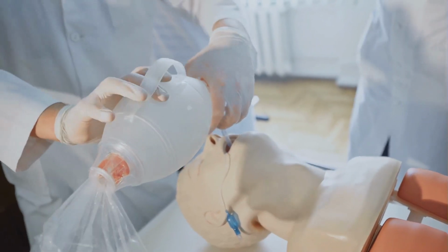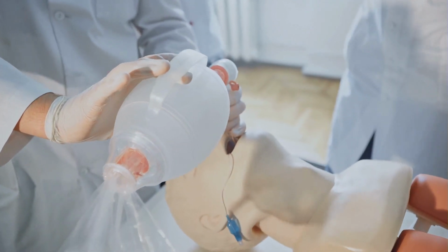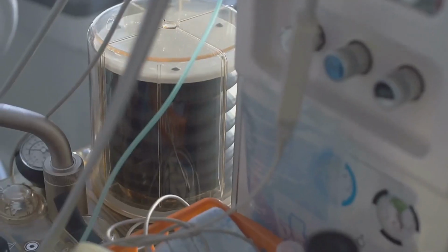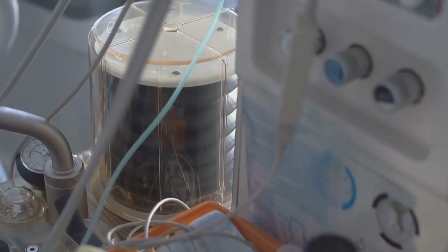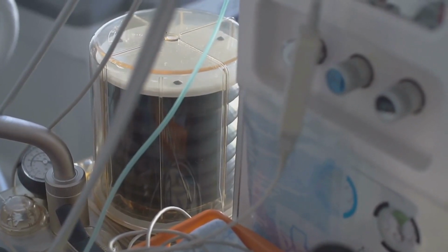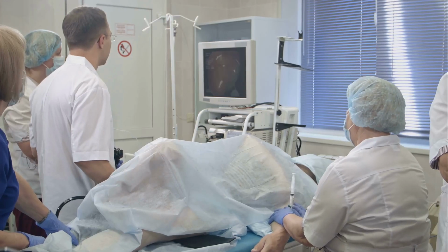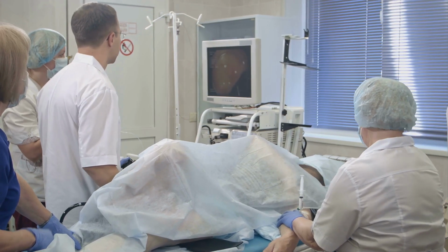Anatomical factors like the presence of an unstable cervical spine or limited mouth opening can pose additional hurdles. Furthermore, patients with a full stomach or predisposition to aspiration are at higher risk during awake intubation. Also, it's important to consider the clinician's experience and comfort level with the procedure. Awake intubation requires skill and familiarity with the equipment, which can be a limiting factor.